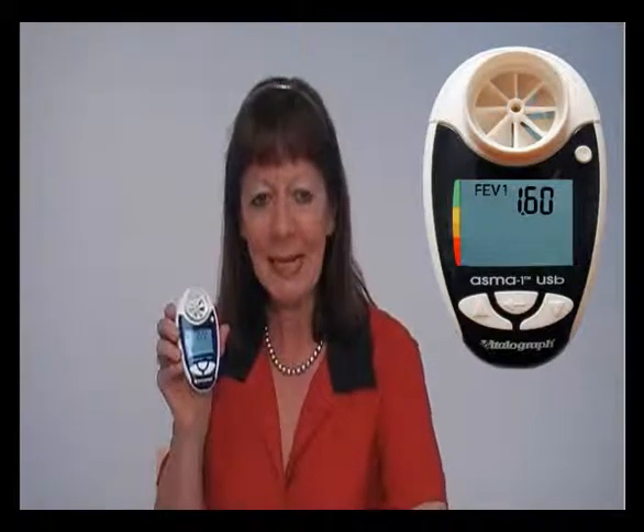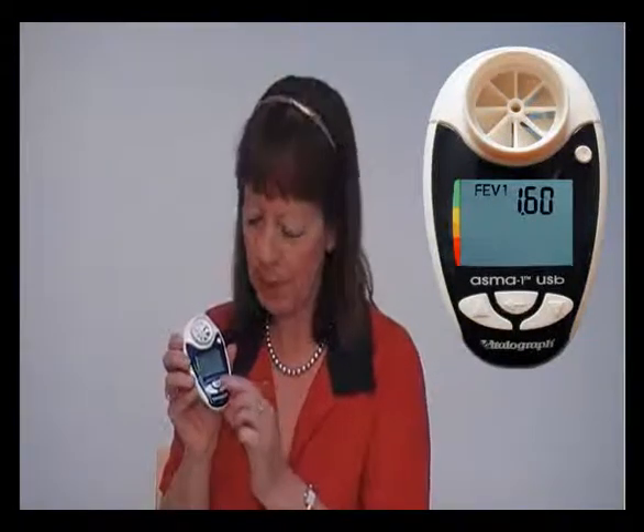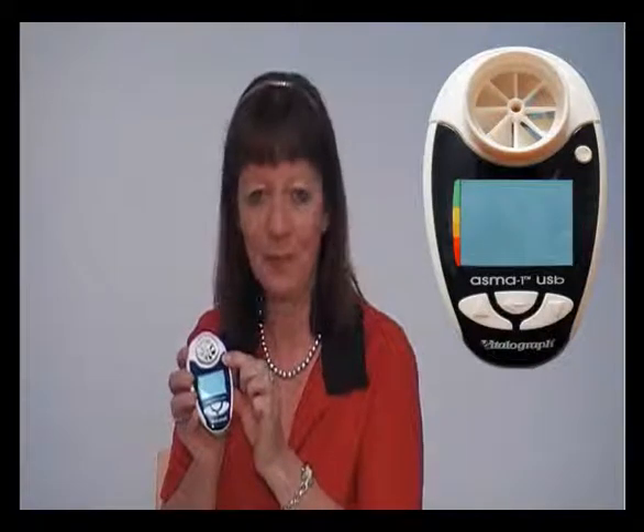Press the middle enter button to display the best blow. Use the circular button to turn off the device. The AsthmaOne will automatically store the best values from the session and will store up to 600 test sessions.